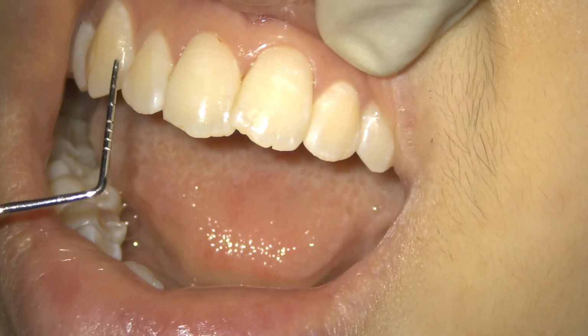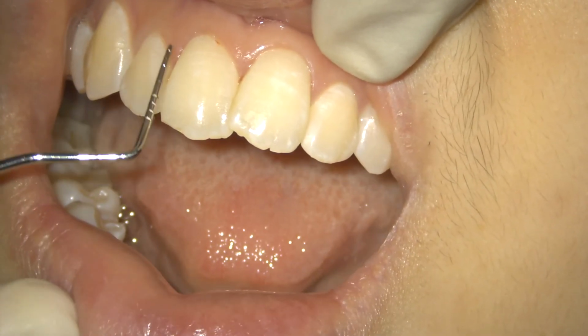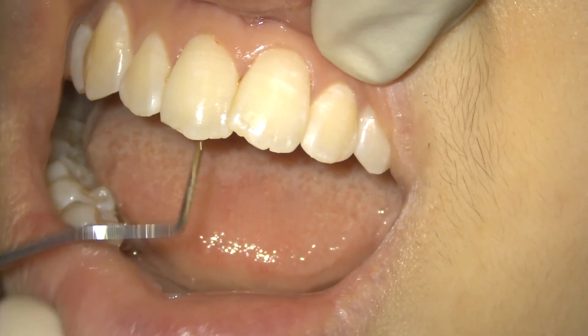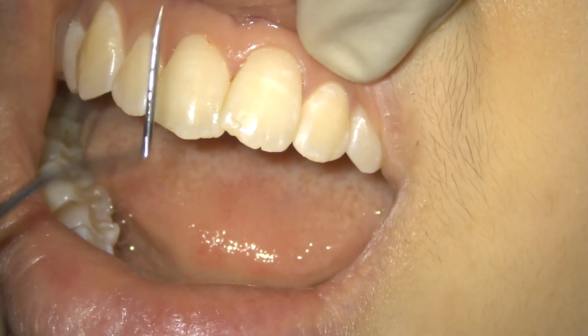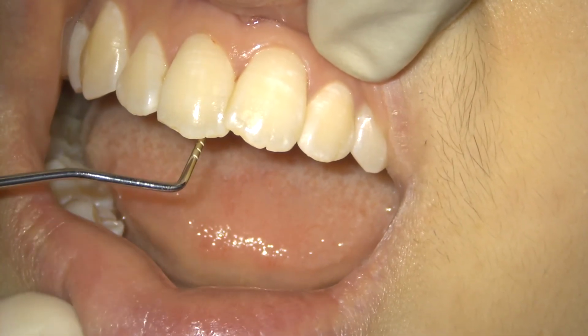Sometimes when you record periodontal charting in a periodontitis patient, bleeding can be assessed even on 6 points, like 3 points on the buccal and 3 points on the palatal. But for regular patients, for all the other purposes, whenever you are checking any patient, you can check on the 4 surfaces, like 1, 2, 3 and 4.